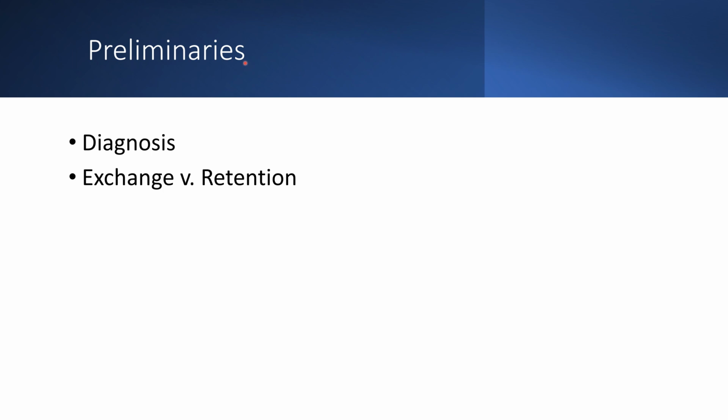So a diagnosis of infection has been made, and the path of two-stage exchange has been chosen. And so I'll walk you through what that path looks like. It is the most common path for the management of Staph aureus and chronic infection.